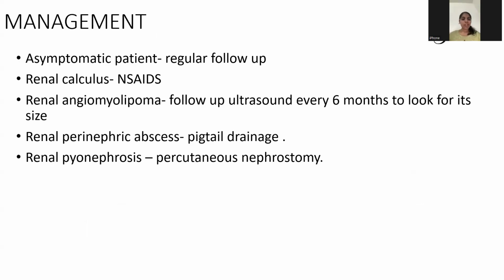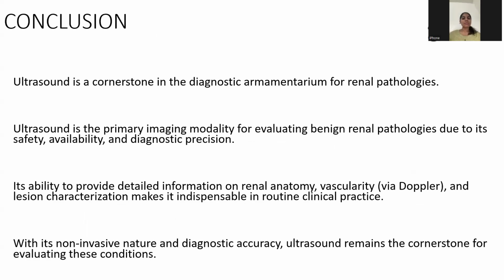Most of the patients who are asymptomatic need a follow-up. Renal calculi are managed by NSAIDs. For renal angiomyolipoma, we give a follow-up every 6 months. For perinephric abscess, we put a pigtail in very severe cases. Same with pyonephrosis, where we go for percutaneous nephrostomy. So ultimately, we have seen that ultrasound is able to diagnose 70% of the benign renal pathologies.